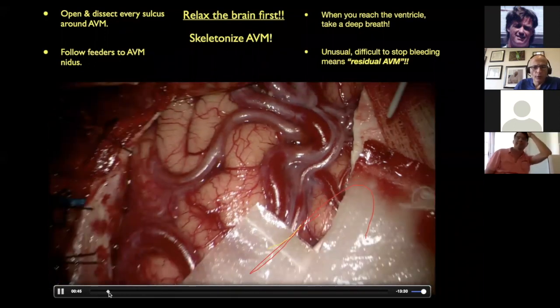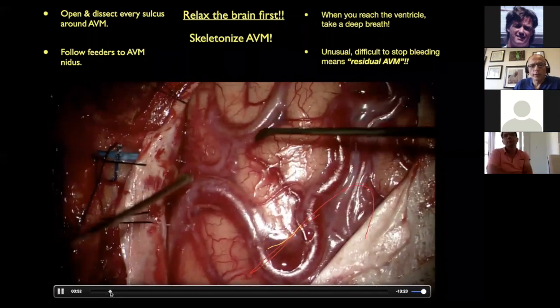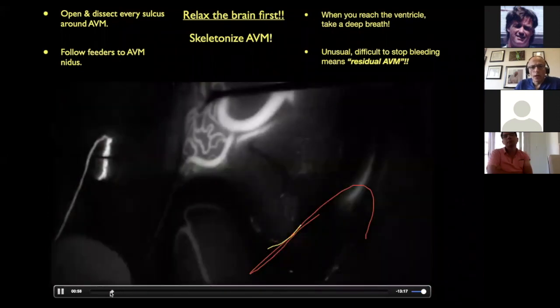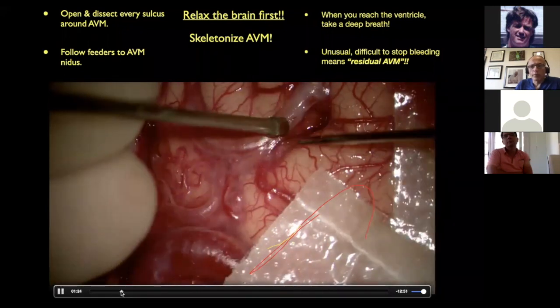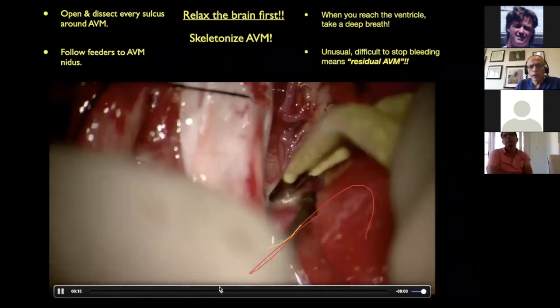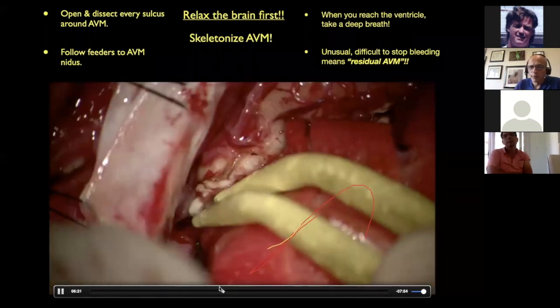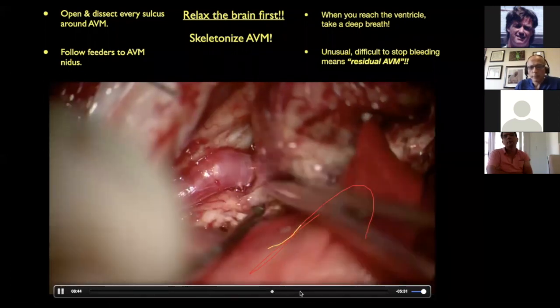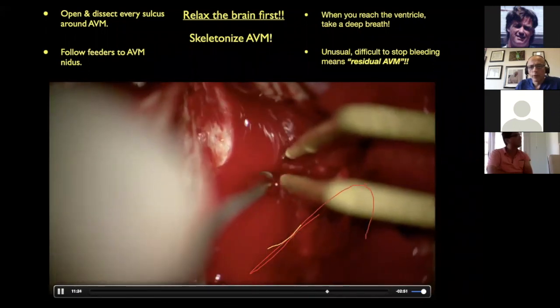This is an old video again, nicely edited by one of my former fellows, Dr. Tefik from Diyarbakir, Turkey. So this is the initial ICG green. I'm going to do the same thing I showed you guys, okay? Dissect, dissect, dissect. It doesn't matter if it's an emergency or not. Do the same principles, okay? Little faster maybe, but that's all. And go around it, go around it, and get into the ventricle.